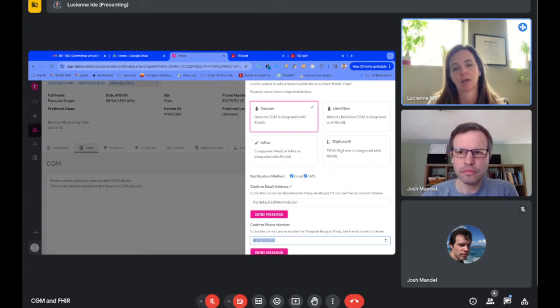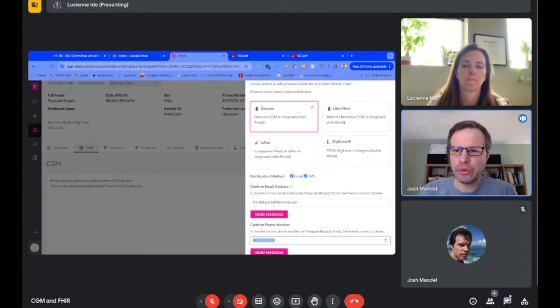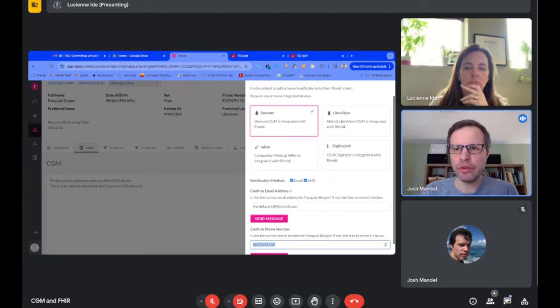I'm going to hit the Dexcom authentication page to log in with my Dexcom credentials. And then I'll hit the page saying, do you authorize Dexcom to share the following data elements to Rimidi? I'll say yes. And then I'm one and done, right? Because then we're going to get the authentication token and the refresh token, and then we'll manage that. So in these scenarios, all of the vendors have some OAuth API that you can use, and they all sort of work well enough for your purposes.